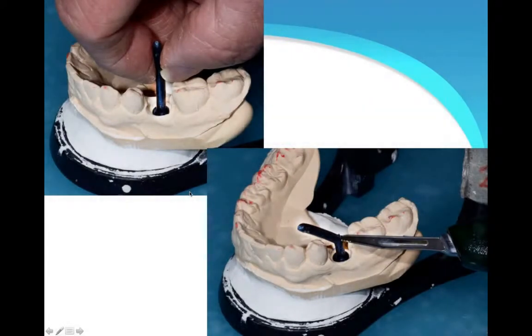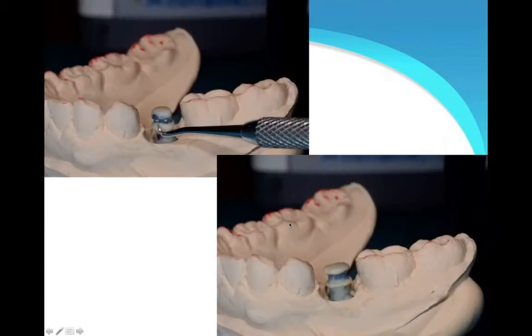So I suddenly had this epiphany, and I went to two of my colleagues, and I said, why don't the implant companies just... I'll show you. That's how I felt. So I shoved a wax wire down inside the implant, nothing to it, just shoved it in, cut it off to height.